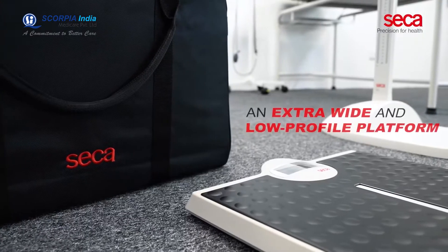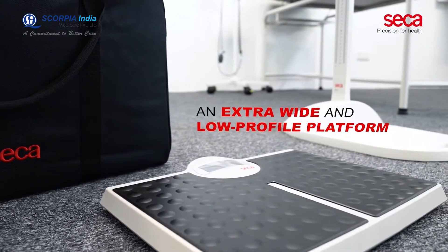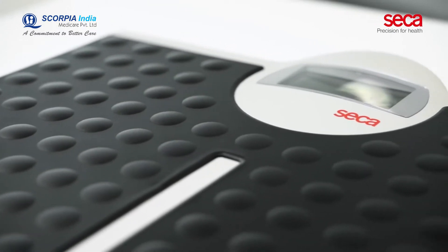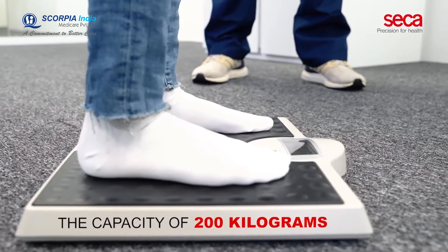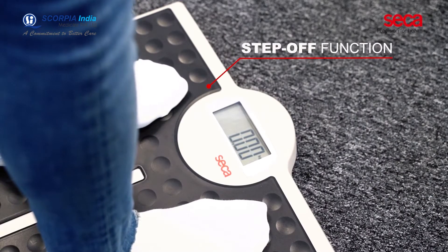The CECA 813 Flat Scale features an extra-wide and low-profile platform. These features make it the perfect scale for obese patients, able to withstand a capacity of 200 kilograms. The unique step-off function of the scale enables you to activate it just by stepping on.